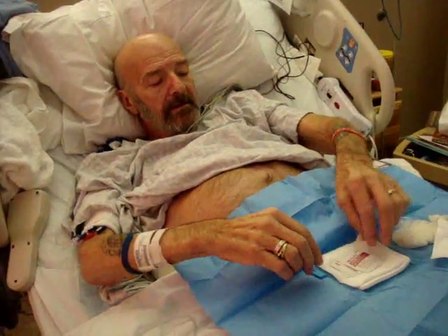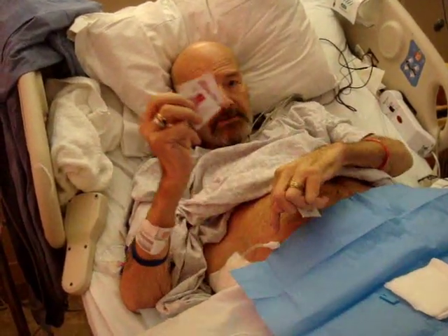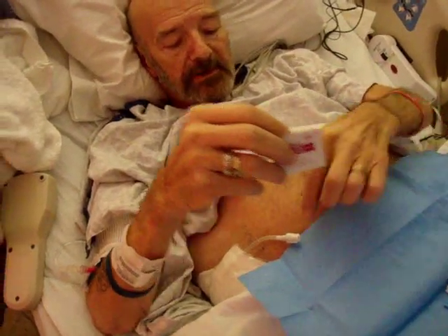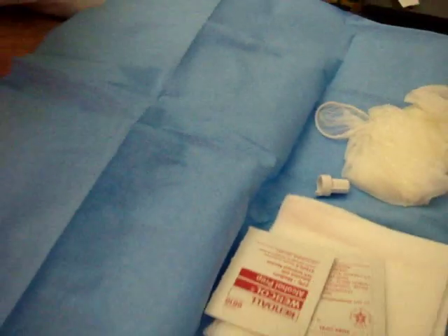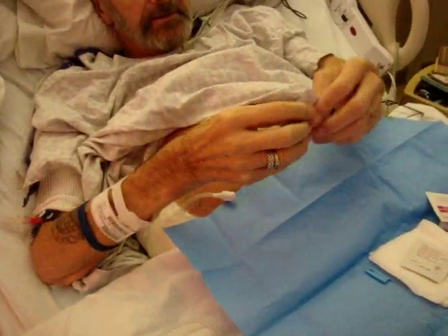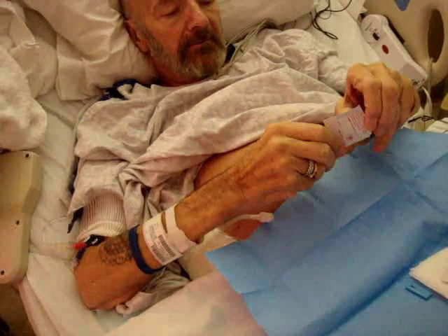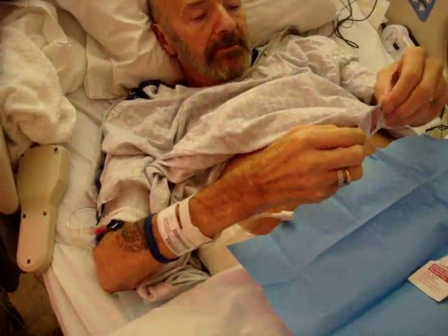The gauze — I'll need two of them. The three uses of the gauze are: to clean the catheter when you attach it to the bottle, then clean it again when you take it off and fit a new cap. The new cap is there. And then the third use is for cleaning the site, but you only do that when you change the dressing. So this should be a much simpler operation. The instructions say you don't take it all the way out, but you get it ready and can put it back down in the sterile area.